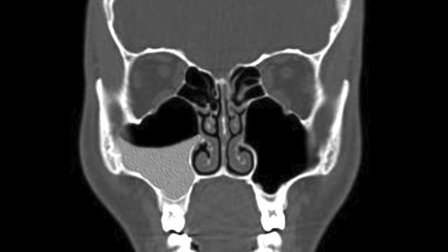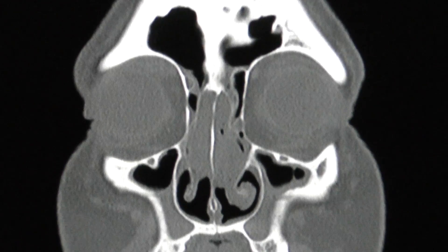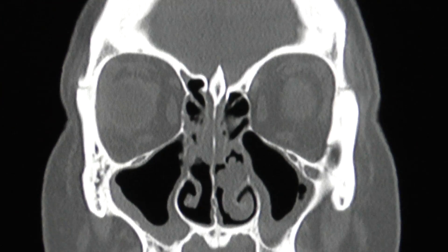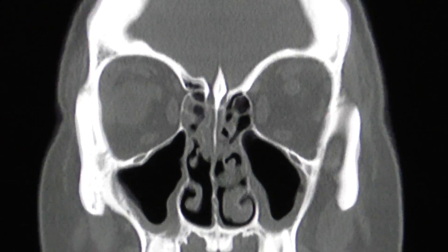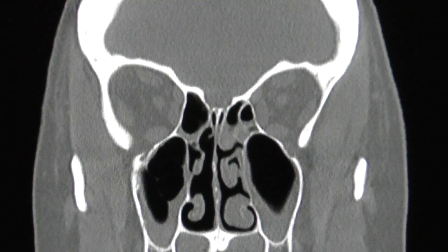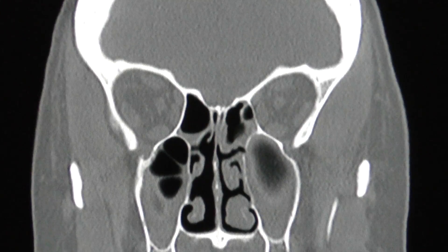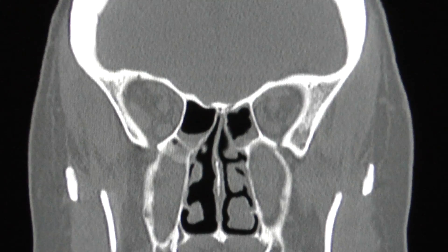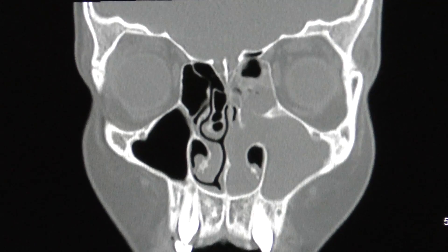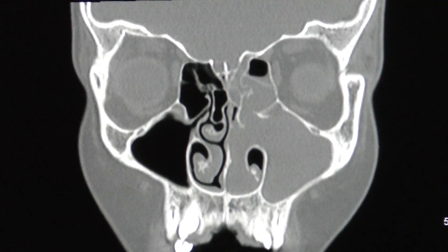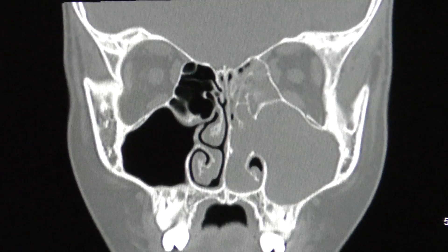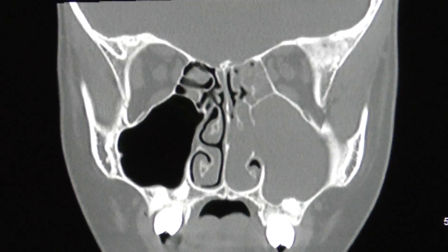If mucosal swelling suggestive of chronic sinus disease is present, there would be a more circumferential gray discoloration around the sinus cavities as shown here. If extensive nasal polyps are present, there may be very little black or air present in the sinus cavities.